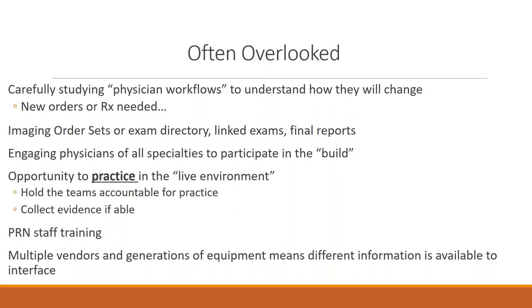At this point is when you really want to break the system, or see if it's going to break, before you go into the live environment. And you need to hold the team accountable. They should submit how many studies they did each day, because if you don't hold them accountable, it's hard to do that when you're in your normal work environment. You're very busy. Collect evidence available when it breaks.